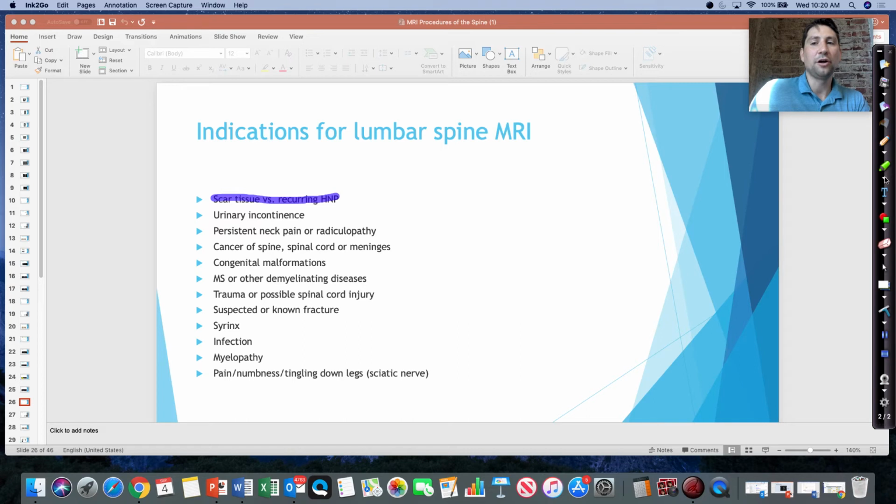One that you would get called in for, say if you're working at Main Hospital, Kiera, where you're on call on the weekend and they don't have an MR tech. One of the main reasons you get called in is for this urine incontinence. So this is one of those stat exams. They want to find out, why is this patient unable to urinate? They almost don't have any of that sensation in their lower half of the body.